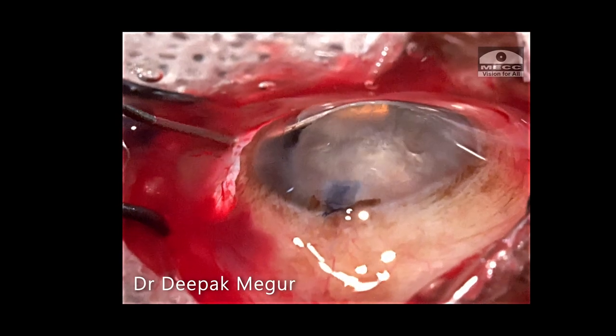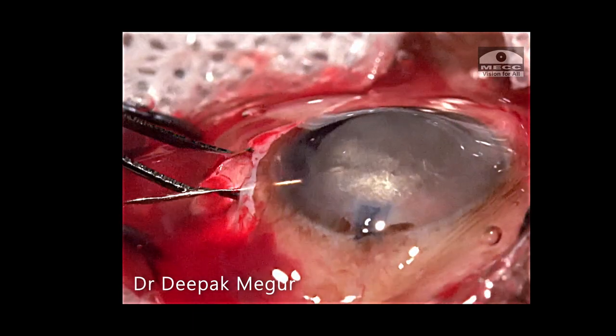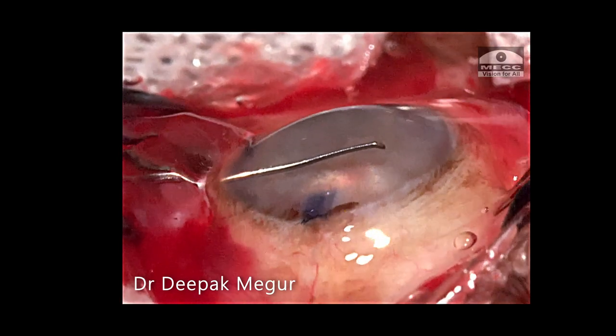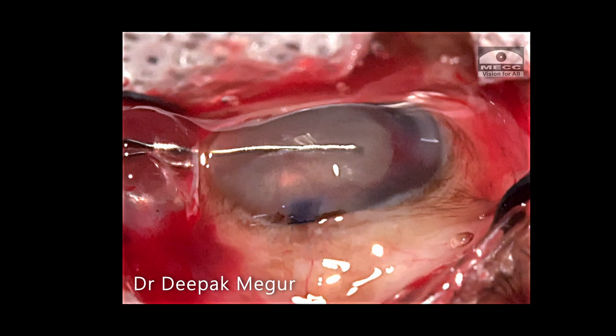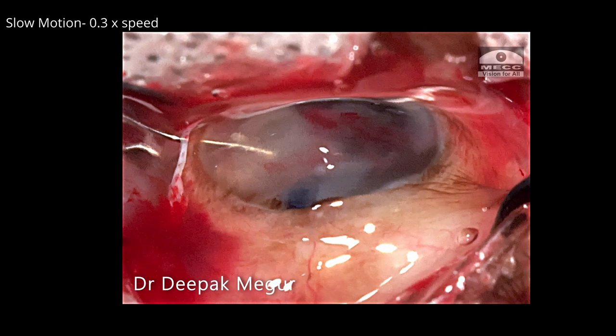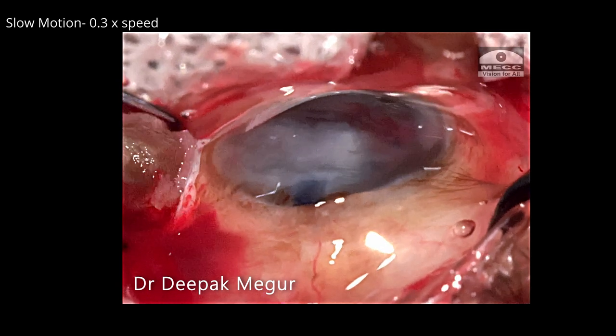Let us observe these steps from the side. OVD is placed below and in front of the nucleus, then the vectus gets under the nucleus and the dialer above it. It's important to note the vectus is engaging only two-thirds of the length of the nucleus — this ensures that the iris is not engaged. The dialer pushes down on the nucleus, encompassing it between the vectus and the dialer. Then the entire mass — the dialer, the lens, and the vectus — are gently pulled out through the sclerocorneal tunnel.